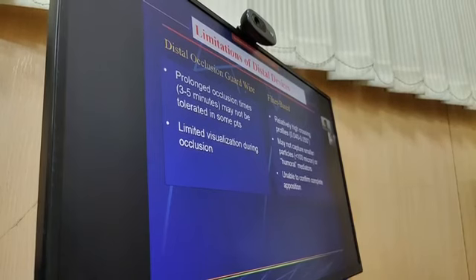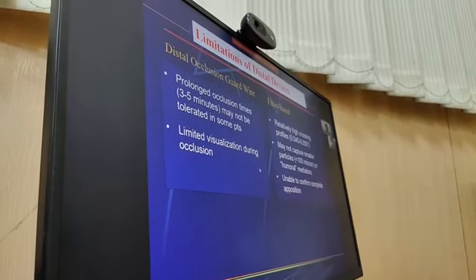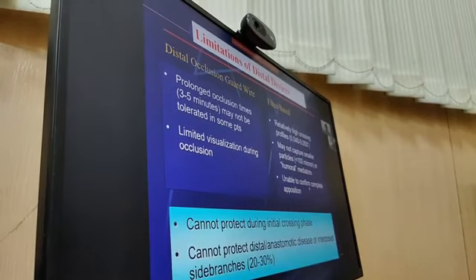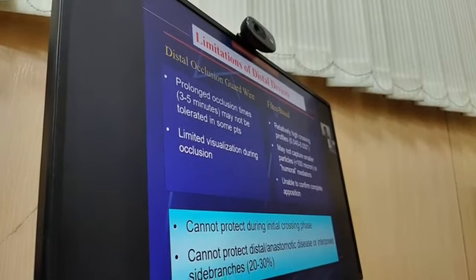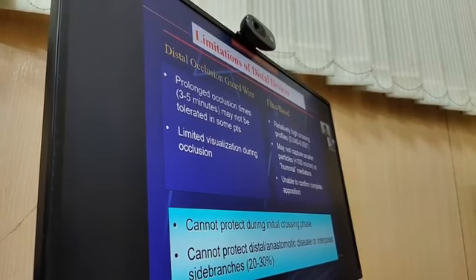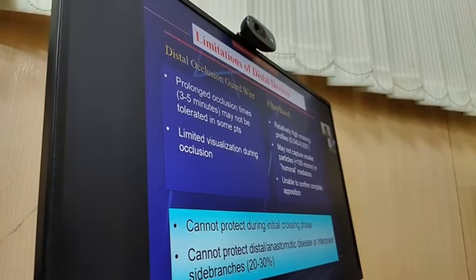In proximal protection that is not there. Plus, very small particles, less than 100 micron, and something which may go beyond the circumference of the protection device, all those things can occur.